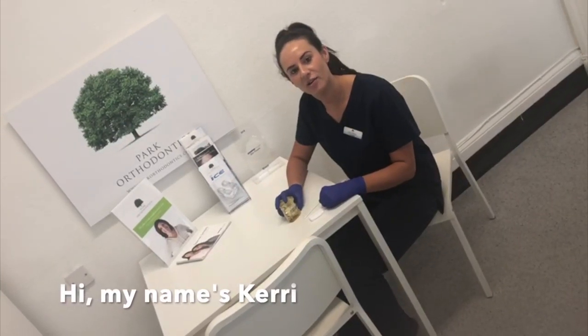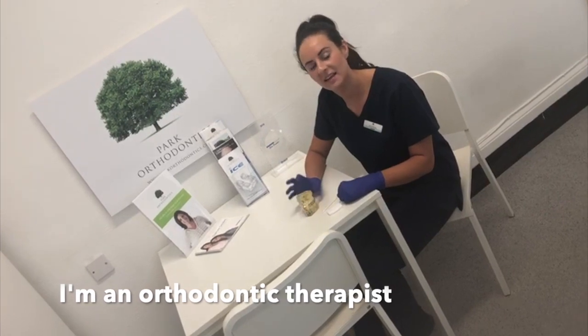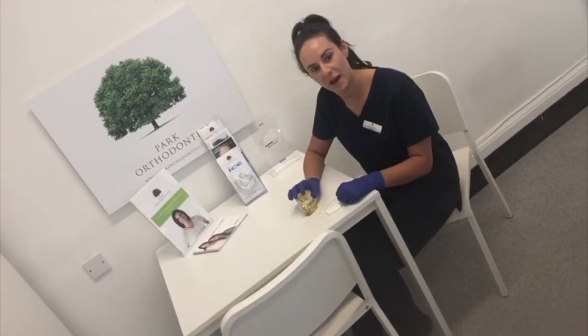Hi everyone, welcome to Park Orthodontics. My name is Kerry, one of the orthodontic therapists based in practice, and today I'm going to show you how to apply wax to your fixed brace.